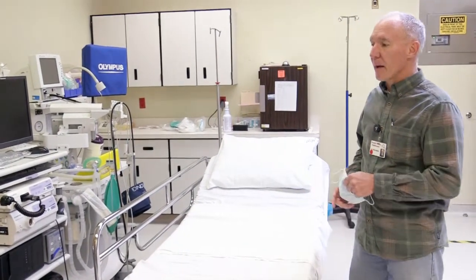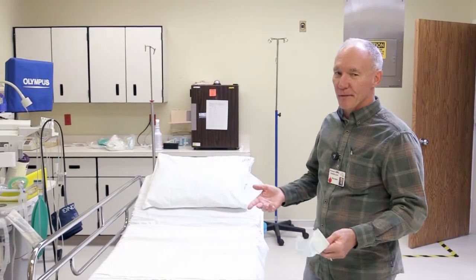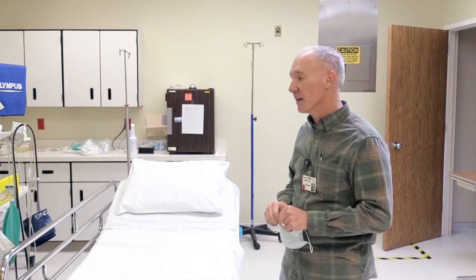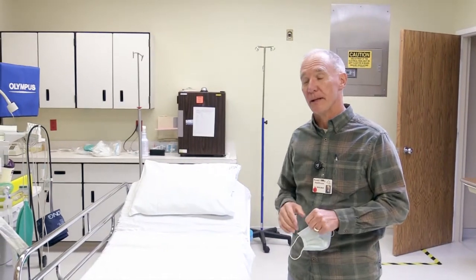So basically they bring you back here. We get all these consent forms, it requires a bunch of paperwork to do, but we'll get the consents all done, and then the anesthesia guy will start giving you the medicine that makes you sleepy.